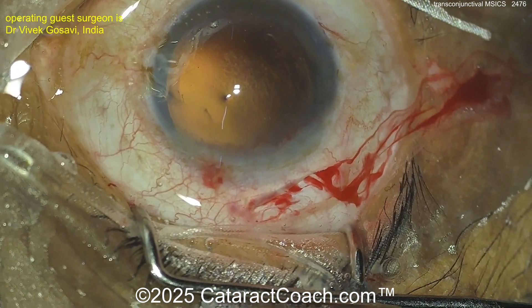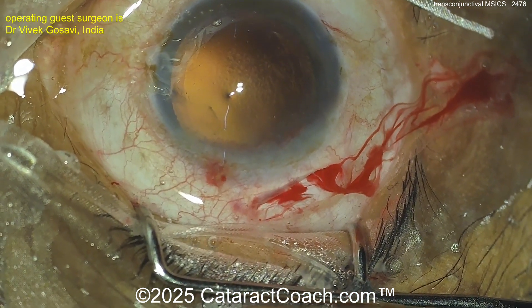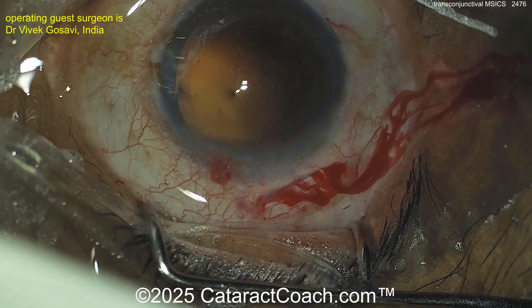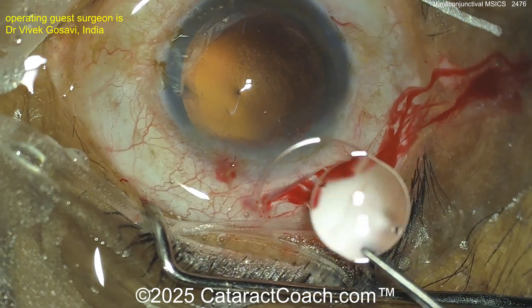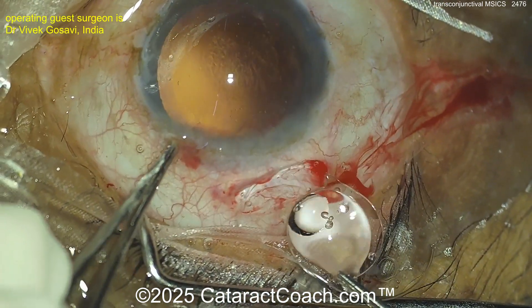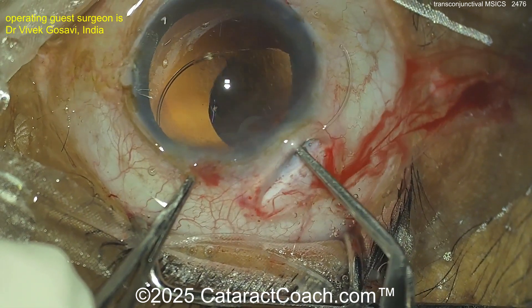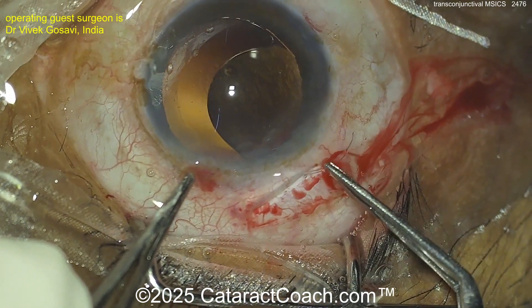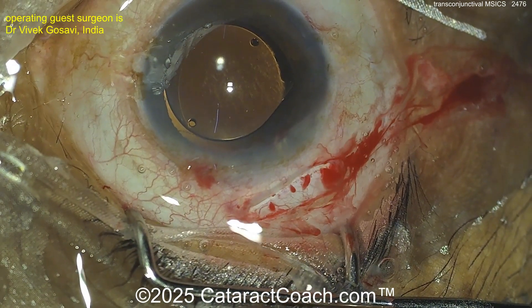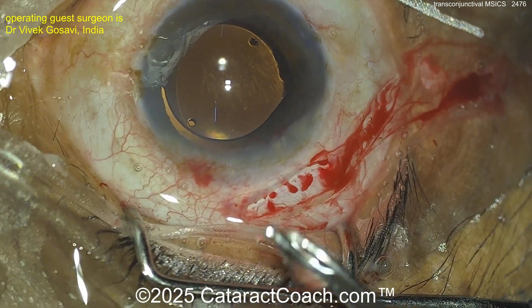There's the viscoelastic to fill the capsule bag. Let's see the lens choice — in my center I don't know if we have any PMMA lenses other than anterior chamber IOLs. And yes, there's the PMMA lens — it looks almost like three-piece but it's actually single-piece. Get that into the capsule bag nice and easy. You can see it also has holes at the edge of the optic for positioning if needed.